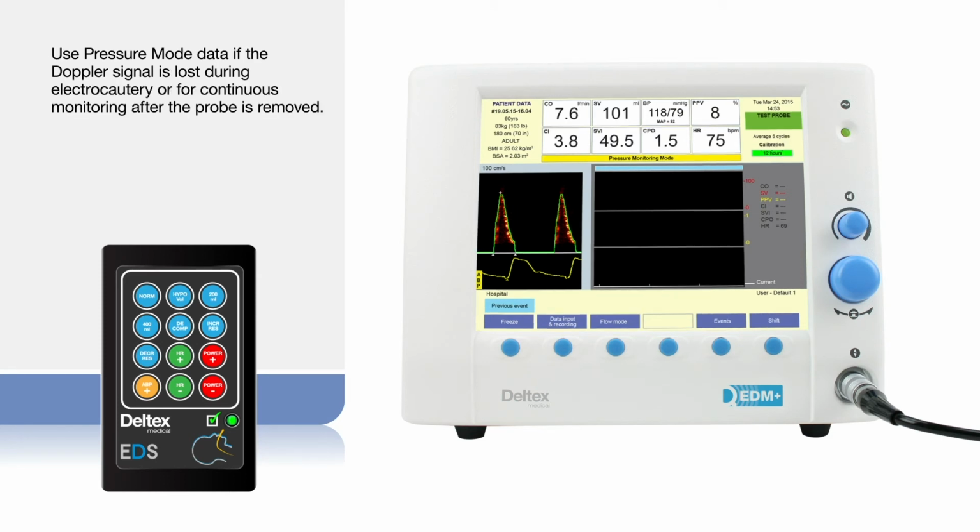Derived data can be used in pressure mode should the Doppler signal be lost due to electrocautery or during continuous monitoring after the probe has been removed. If you toggle between flow mode and pressure mode, you can see that the data are consistent.